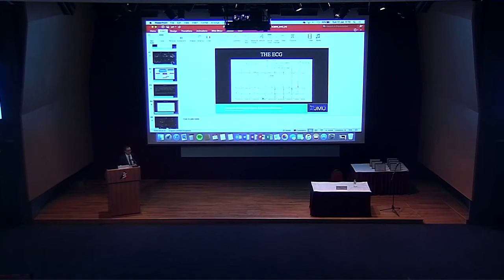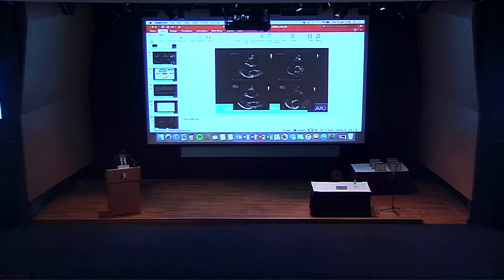Abnormal? Okay. So remember what John said about ARVC and about a T-wave inversion. It's in 2 adjacent leads, but it extends all the way through to here, and there's something going on here. But there's also a massive ventricular ectopic here as well, which is of right ventricular origin. So we're already raising some query about what's going on, and this could be consistent with ARVC. And I'm hoping these images move.